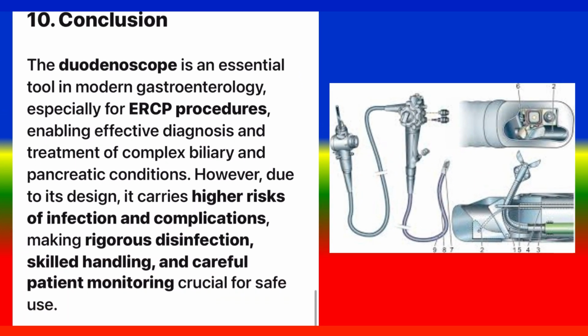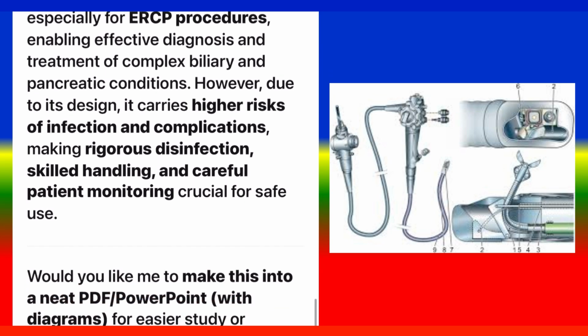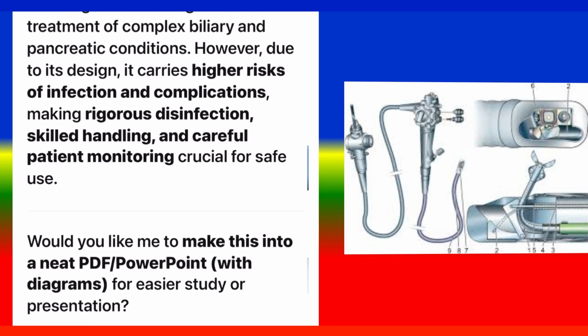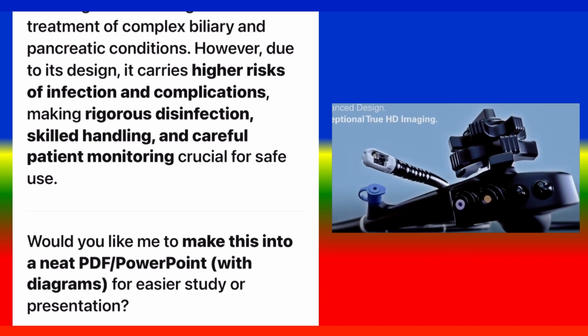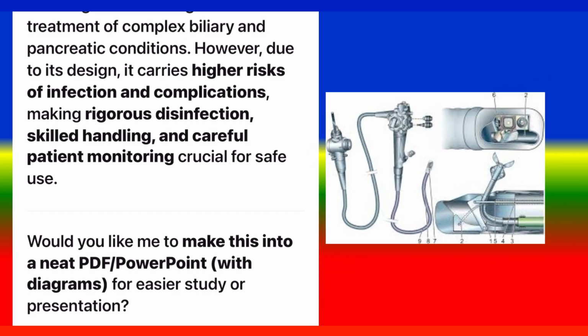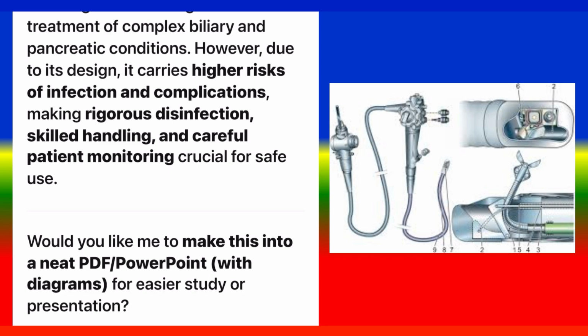10. Conclusion. The duodenoscope is an essential tool in modern gastroenterology, especially for ERCP procedures, enabling effective diagnosis and treatment of complex biliary and pancreatic conditions. However, due to its design, it carries higher risks of infection and complications, making rigorous disinfection, skilled handling, and careful patient monitoring crucial for safe use.